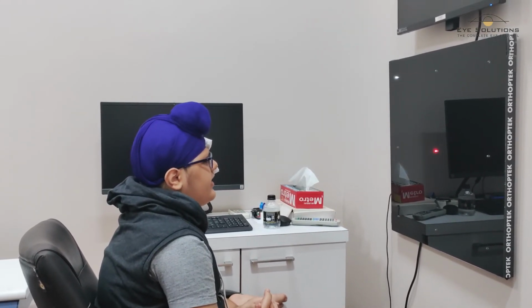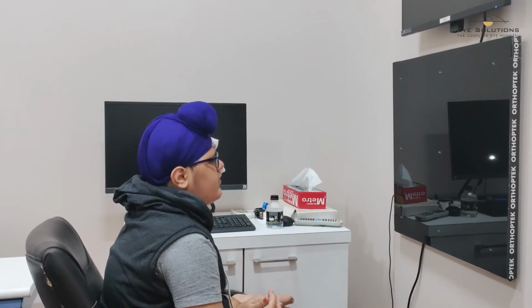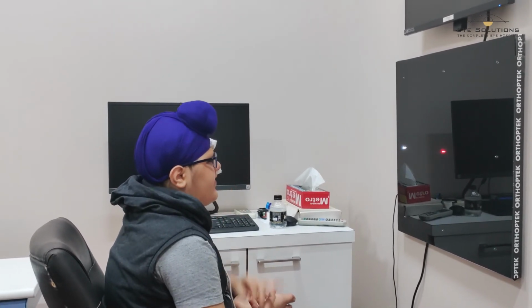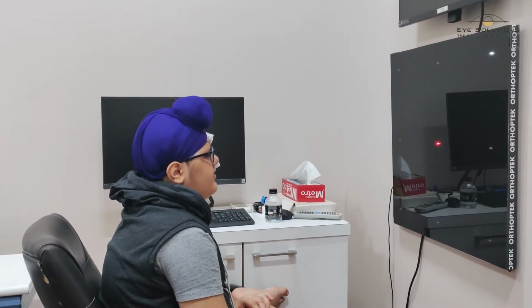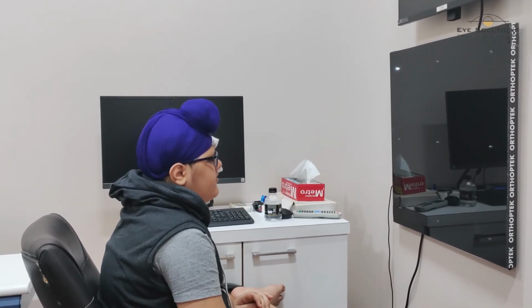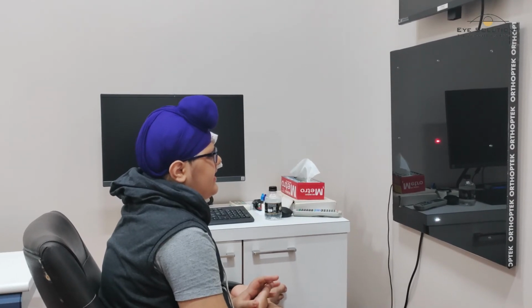He then does the exercise with the strong eye, covering the weak eye, and he counts up to 200 times the peripheral lights coming on. And then he opens both eyes and counts the peripheral lights for 200 times. That concludes the second part of the exercise.